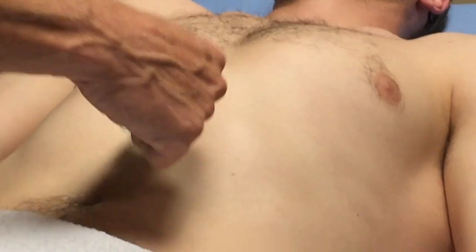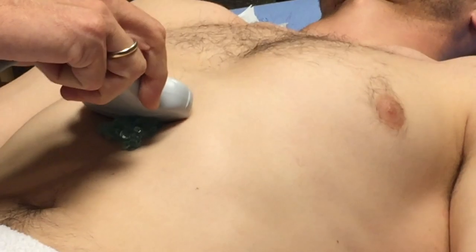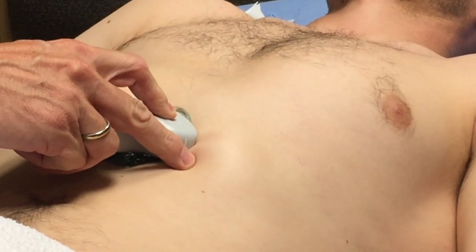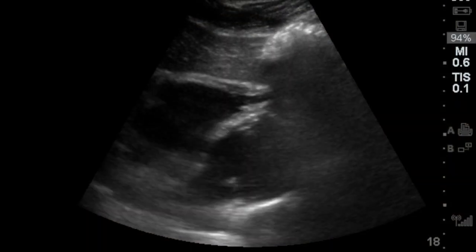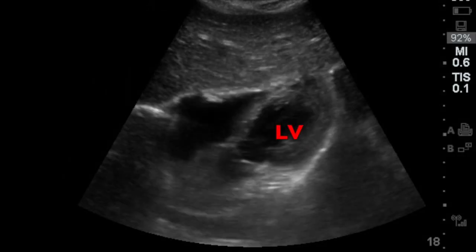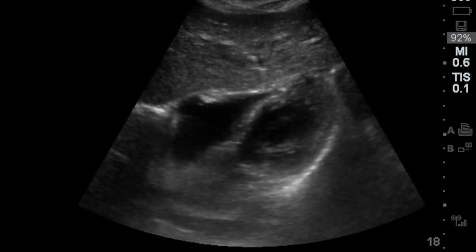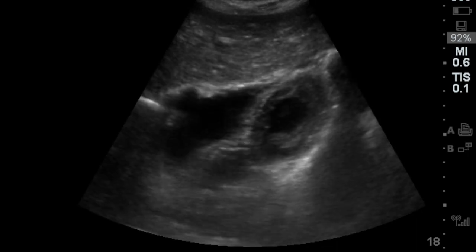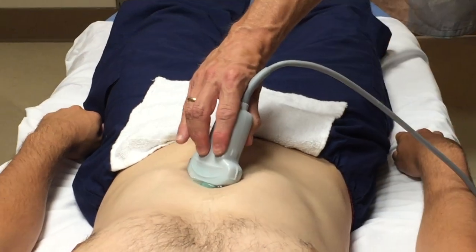I always start with some gel in the epigastrum and take a look at the heart first. I have my probe marker to the patient's right, going right up under the xiphoid, pushing hard and quite flat. If the patient can help, they can take a deep breath and that'll move the heart down closer to the probe. You're looking at squeeze — is it hyperdynamic, is it normal, or is it severely depressed? Those are the main categories. Then we'll go to the IVC.